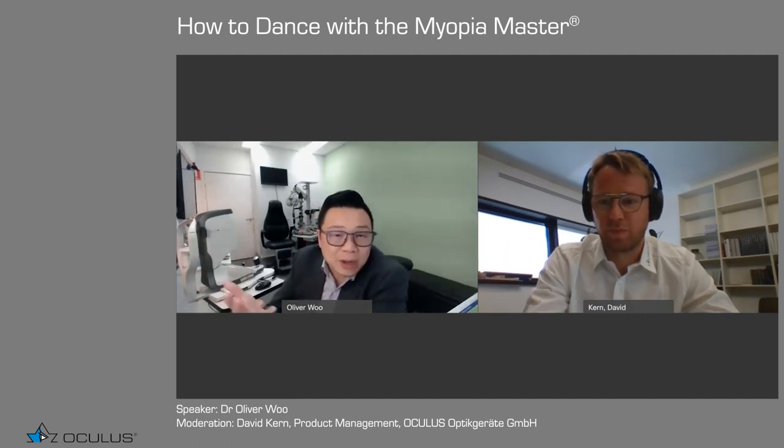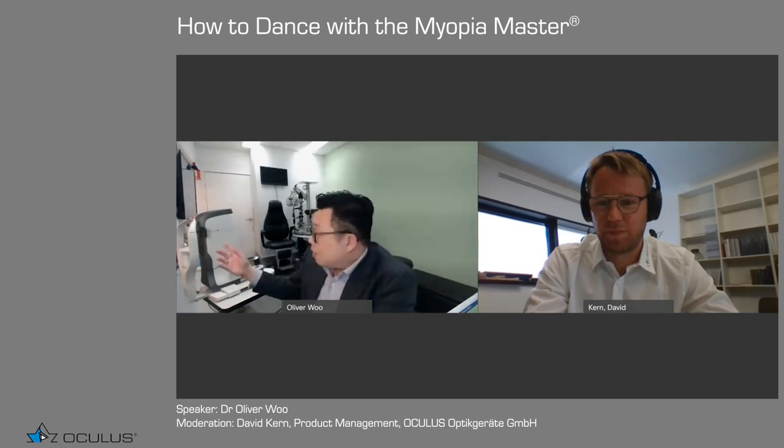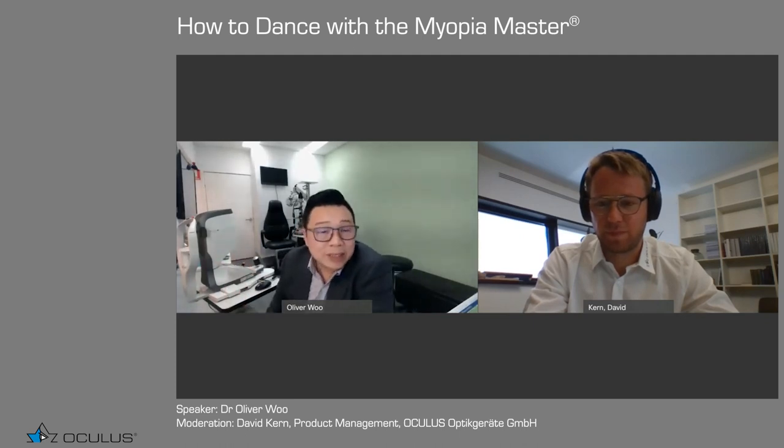So, Oliver, two questions. When do you start measuring pre-myopes is the first question. Basically, I've mentioned, I think probably 7-8 years ago, basically all the kids who came in, I just measured them with the Axial Length device, which just gave me numbers only. But now with the Myopia Master in my practice, basically every single new child patient who comes in, I just do it.